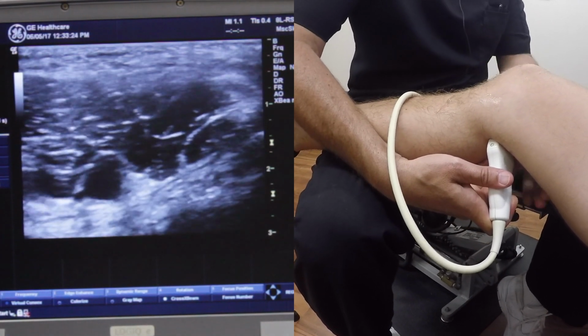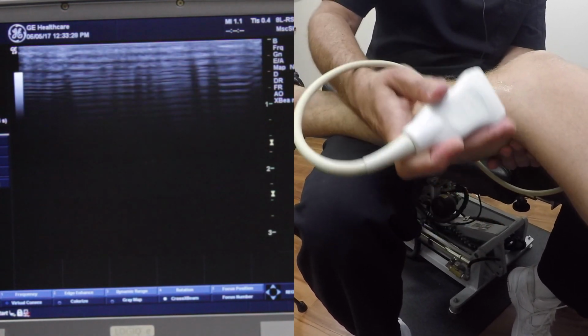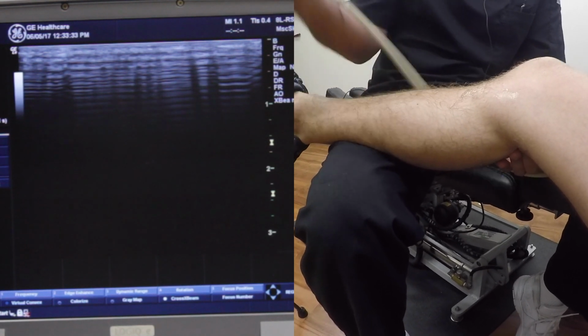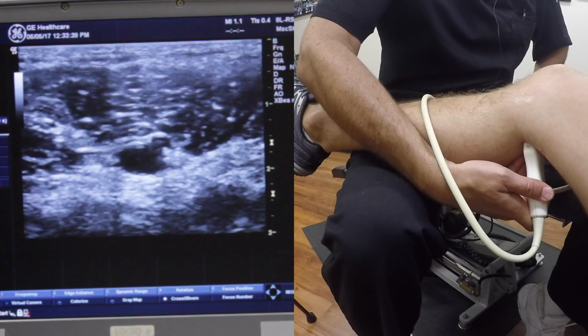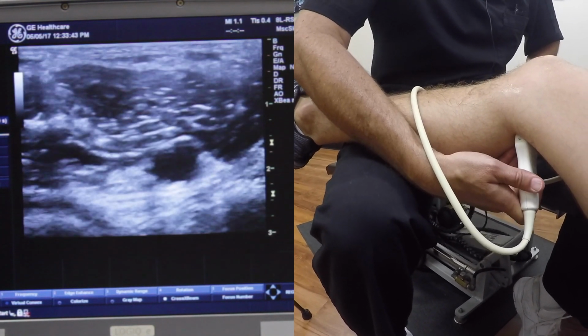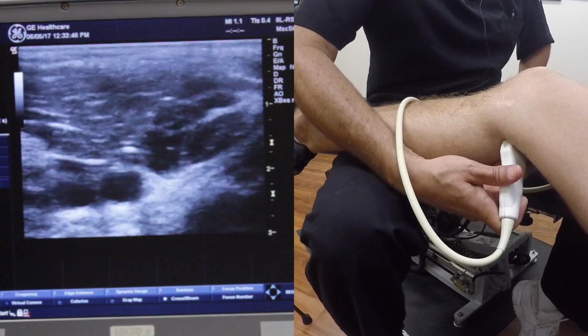Baker cysts are very common. And a lot of times they're not a guarantee. You think there's a Baker cyst and you're just not 100% sure. Get an ultrasound transducer and look inside of there instantly. And in this case, we could see a very healthy popliteal artery and vein. You can see the different popliteal vessels and absolutely no sign of a Baker cyst.